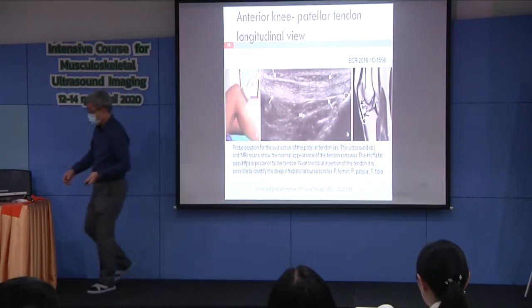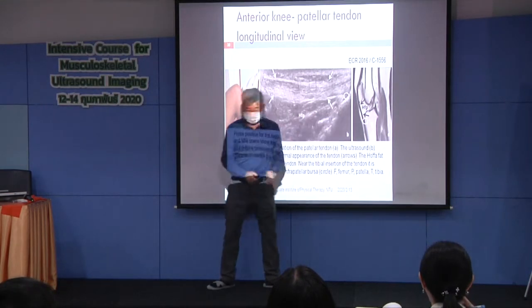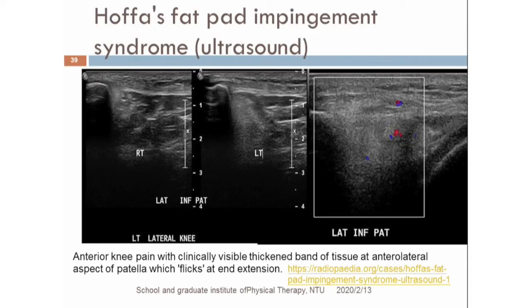Okay, cool. Tibia bone, cortex line. Vascularity, Hoffa's fat pad syndrome. My first case of Hoffa's fat pad syndrome was when I studied in the UK.